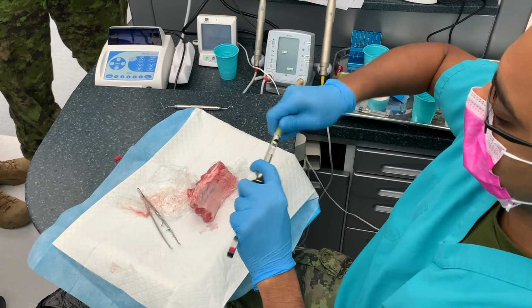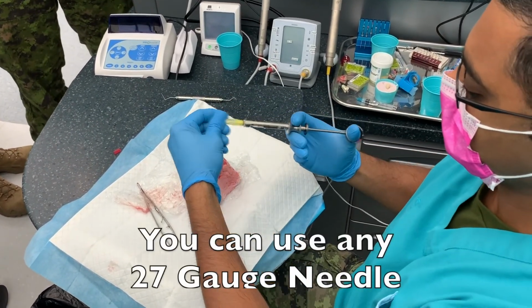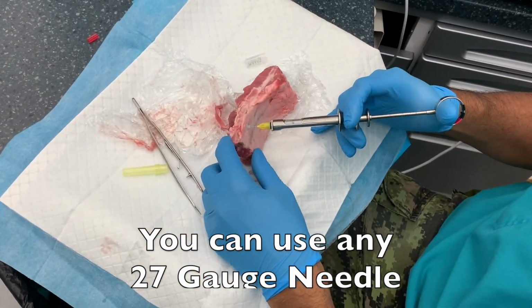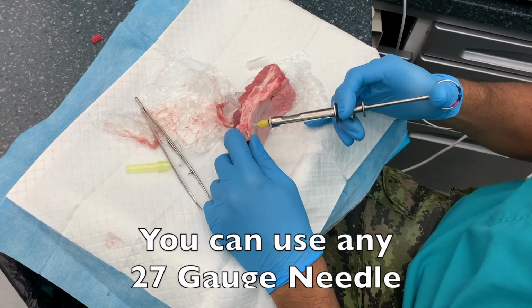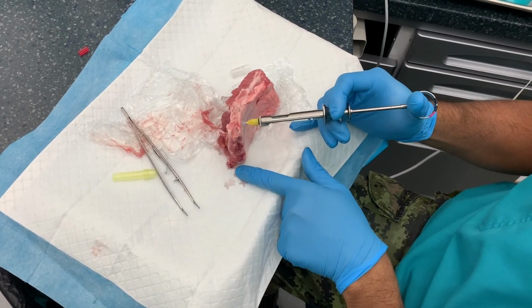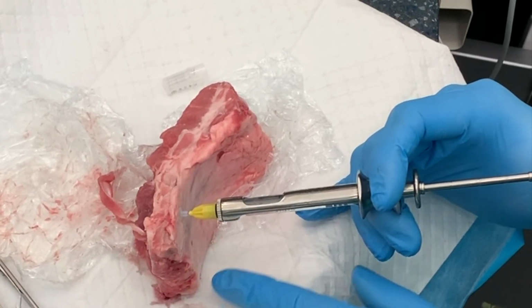So if we're into cancellous bone, it should flow. If it resists, stop and change your location. The moment of truth, I think is a better word. Ready? Bam. My heart's starting to race. You see right there? Oh, I forgot to warn the patient that his heartbeat's going to go up for 4 minutes.